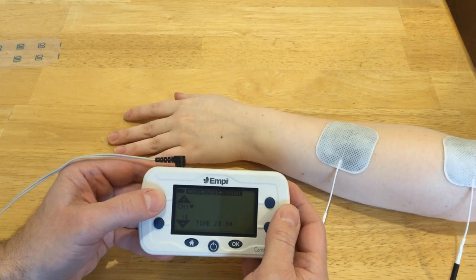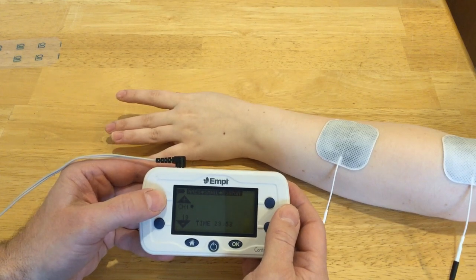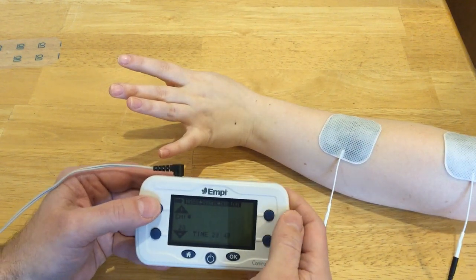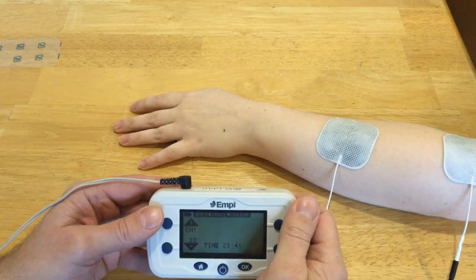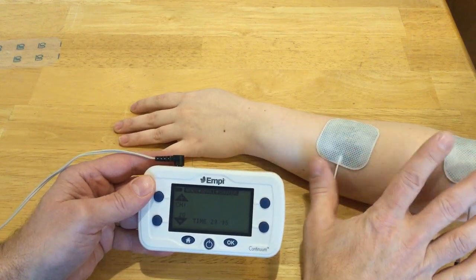Looks like we have extensor indicis and still getting extensor digitorum, and now we're getting more of the radial wrist extensors, which is what I wanted. But we also have extensor indicis, extensor digitorum, and looks like extensor digiti minimi as well — that's just the problem when you're using such a large electrode on the forearm.